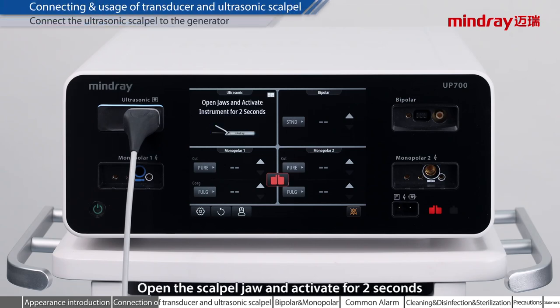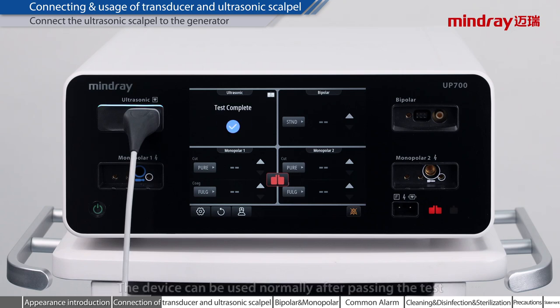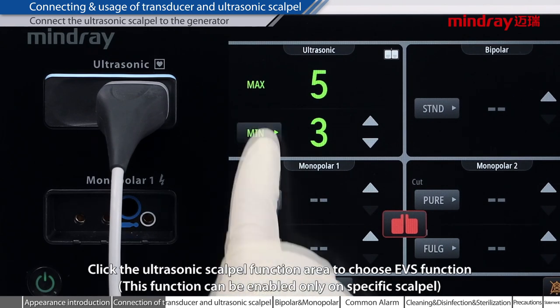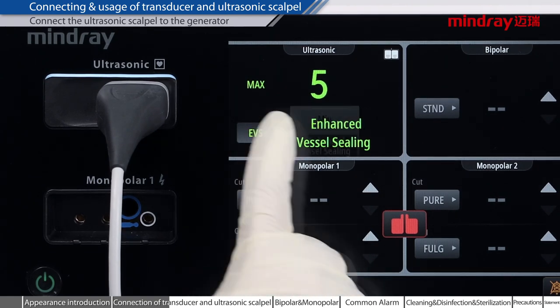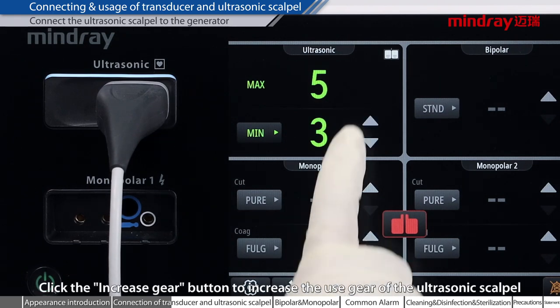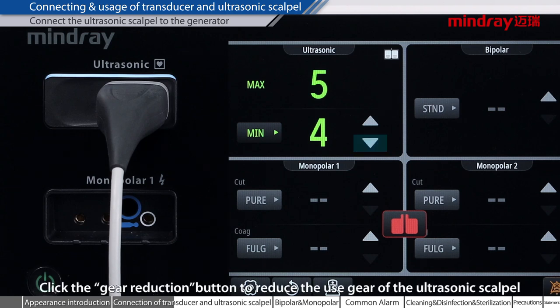Open the scalpel jaw and activate for two seconds according to the instruction in the ultrasonic scalpel functional area. The device can be used normally after passing the test. Click the ultrasonic scalpel function area to choose EVS function. Click the increase gear button to increase the use gear of the ultrasonic scalpel. Click the gear reduction button to reduce the use gear of the ultrasonic scalpel.